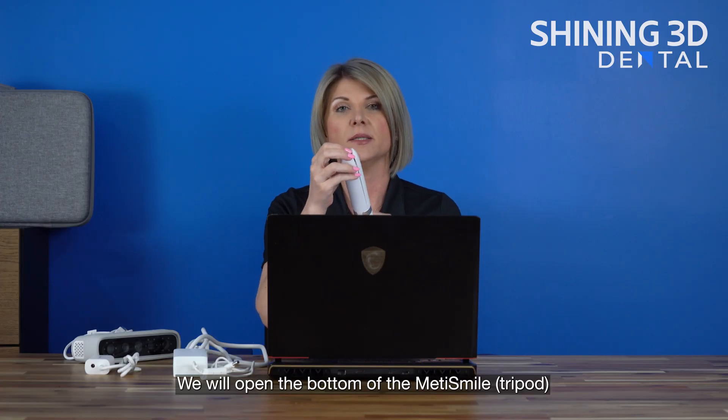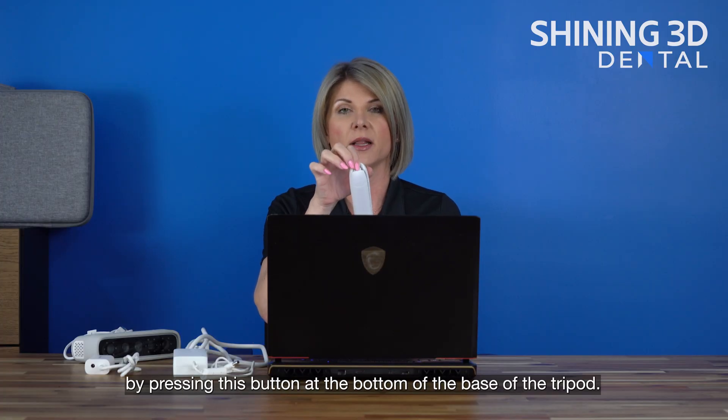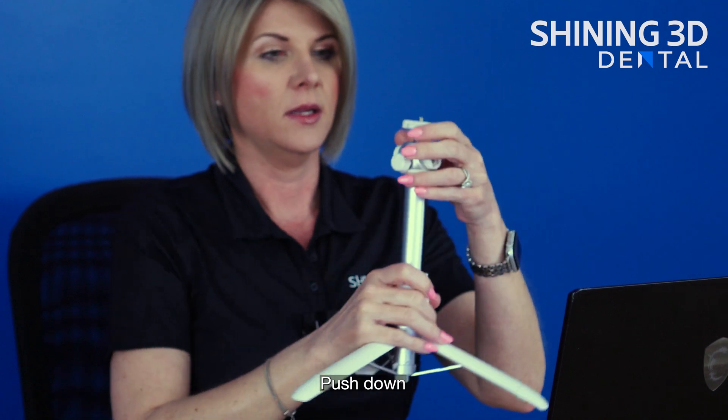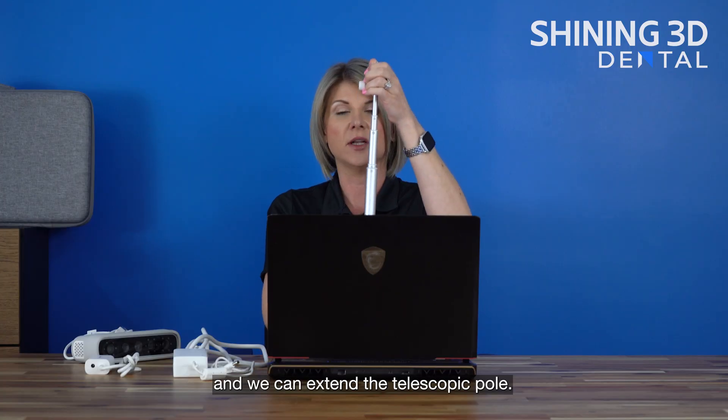We will open the bottom of the MetiSmile by pressing this button at the bottom of the base of the tripod. Push down and we can extend the telescopic pole.